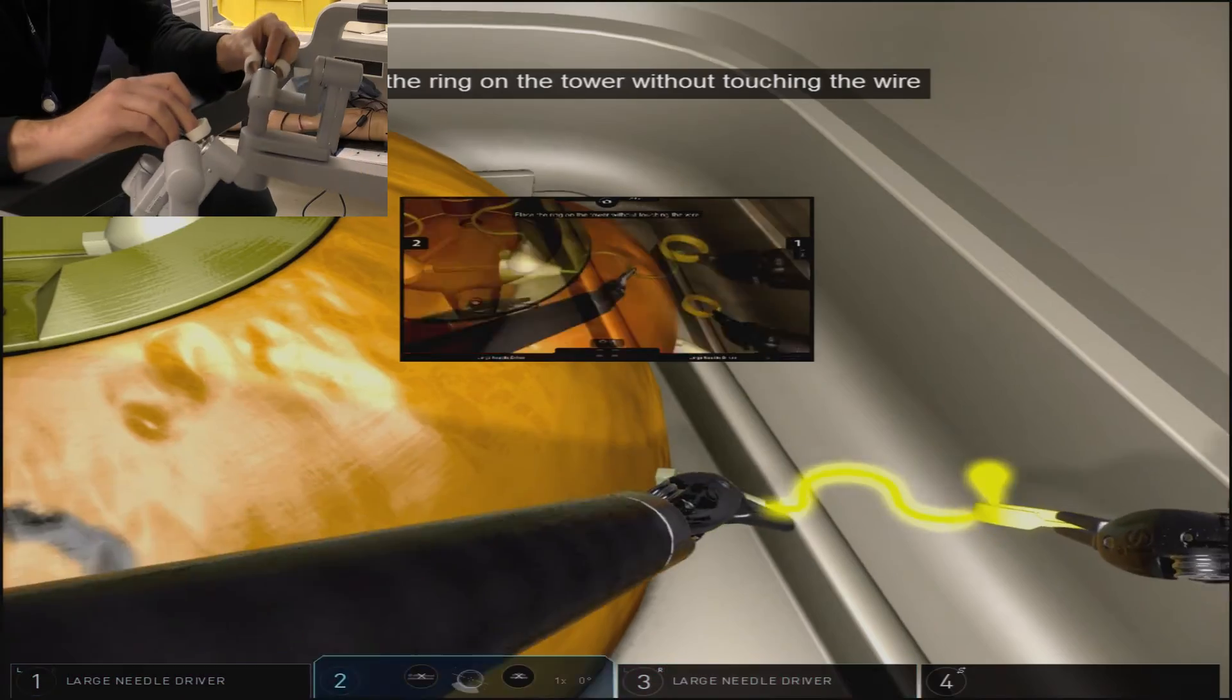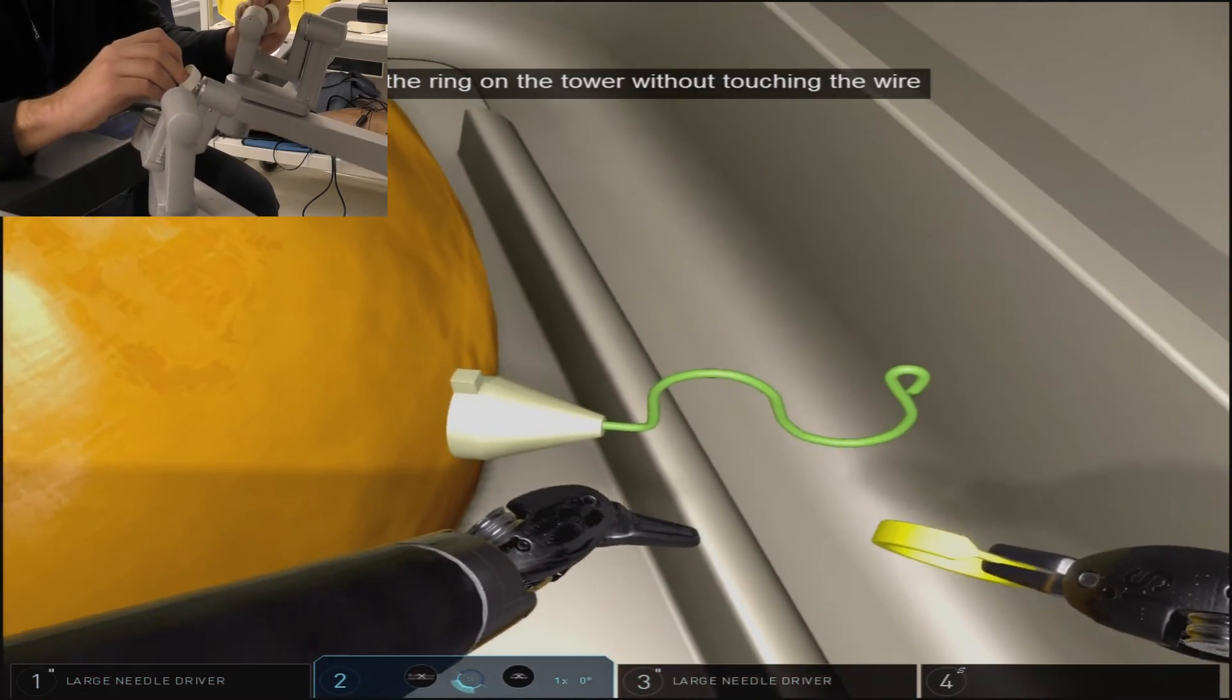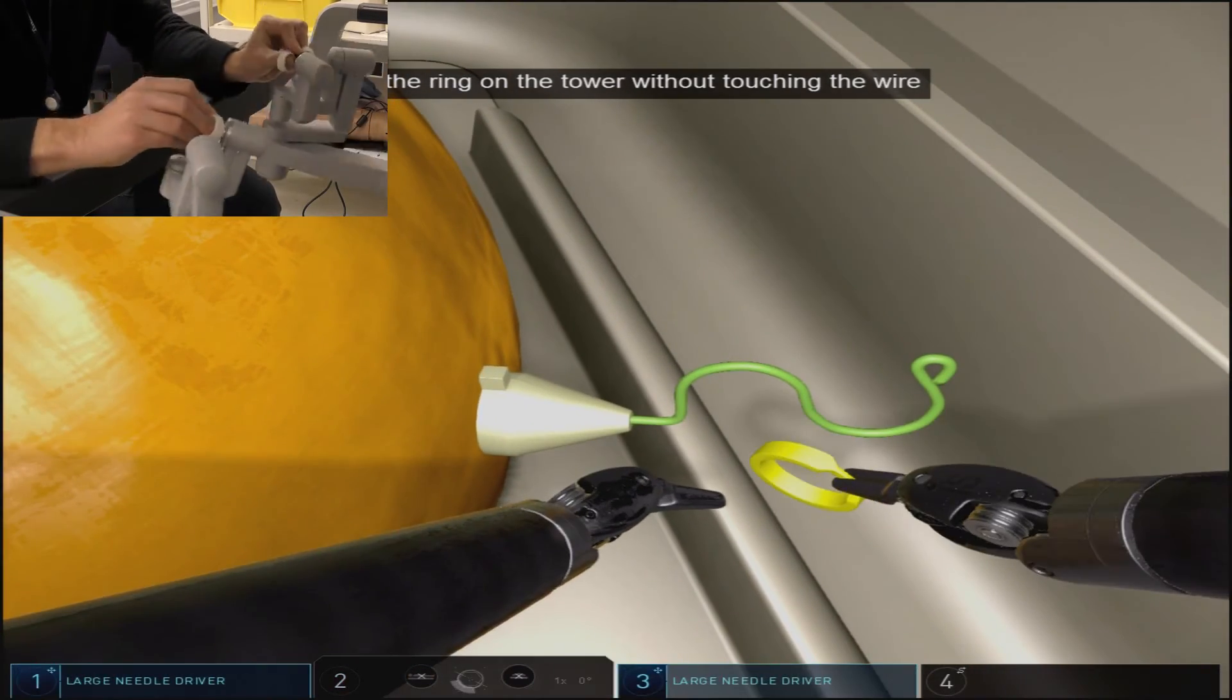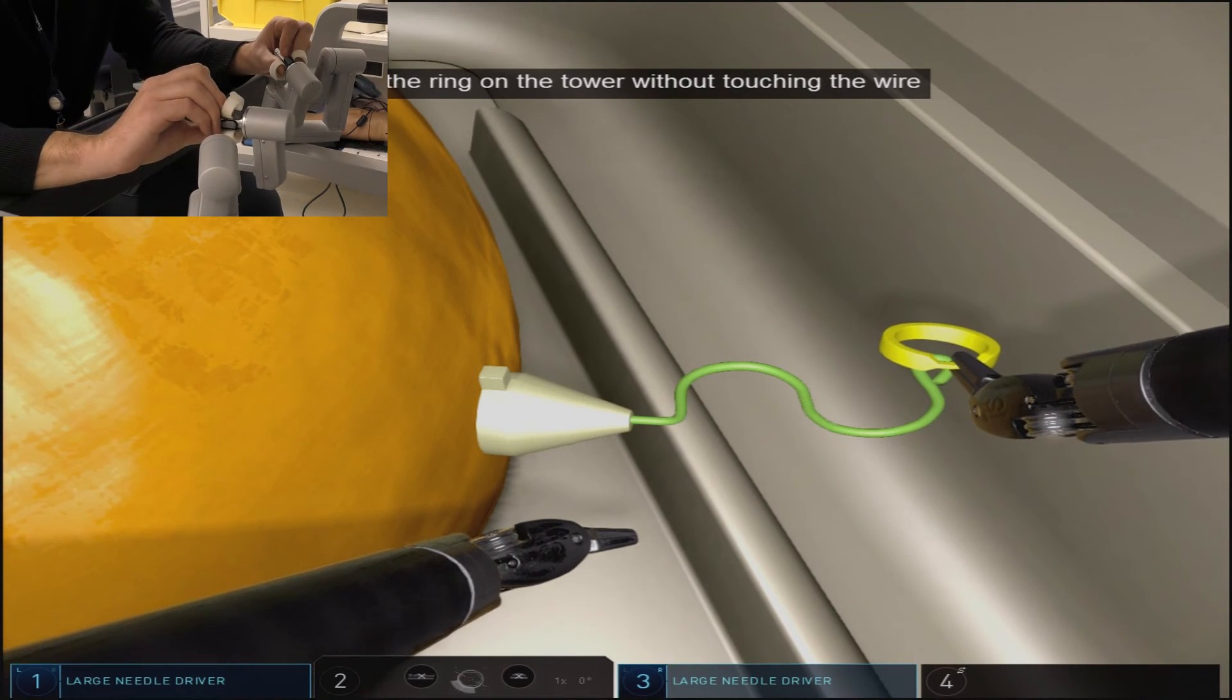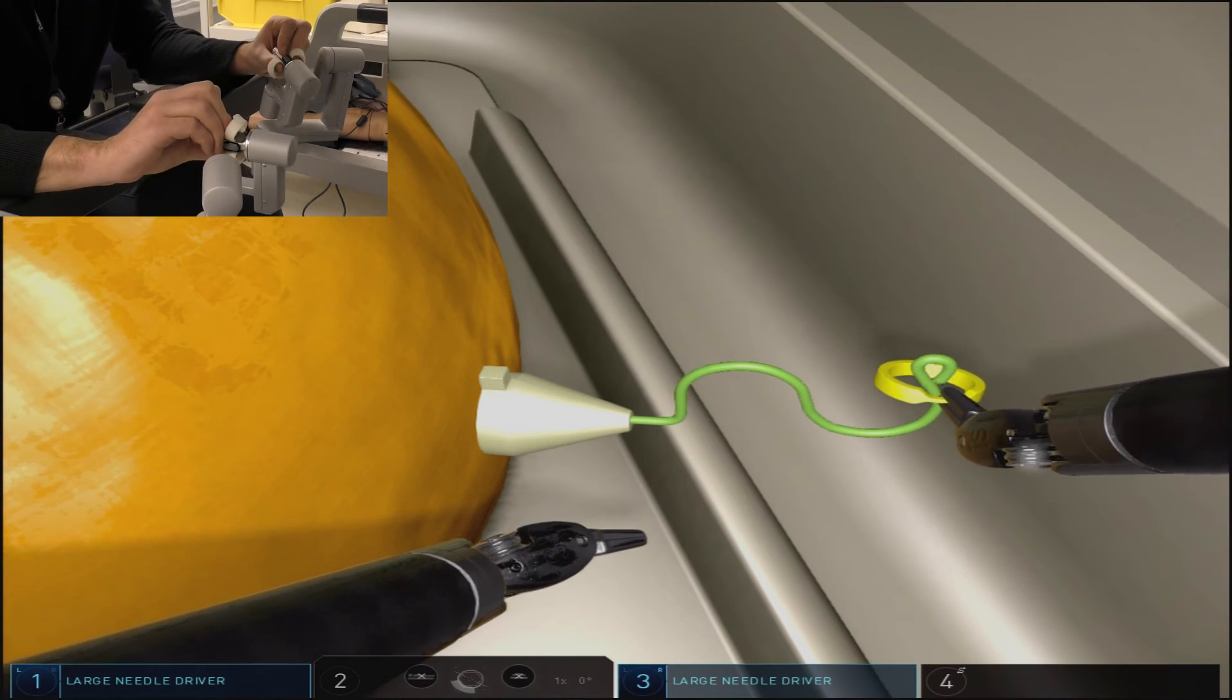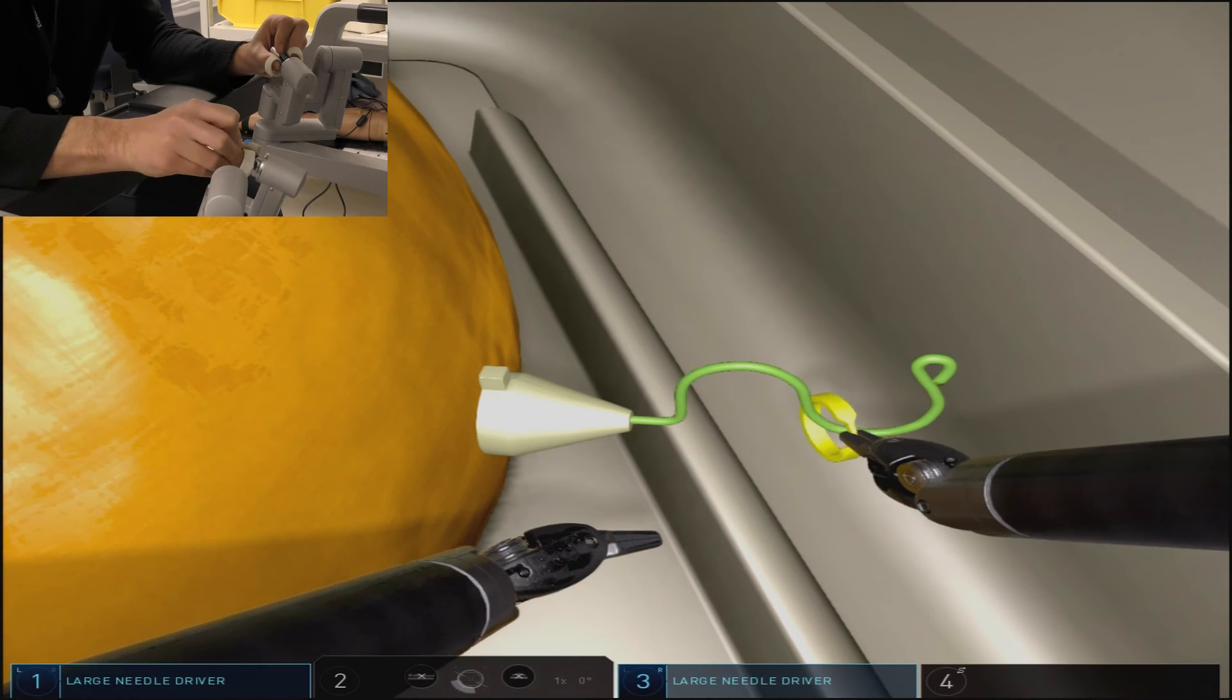Now we navigate towards screen right, and if you'll notice, this ring we have loaded for ourselves in the pronated position, which optimizes our range of motion as we place the ring back on the wire structure.